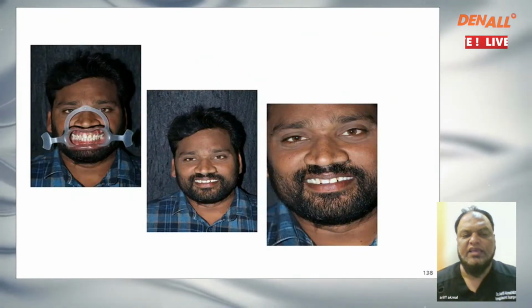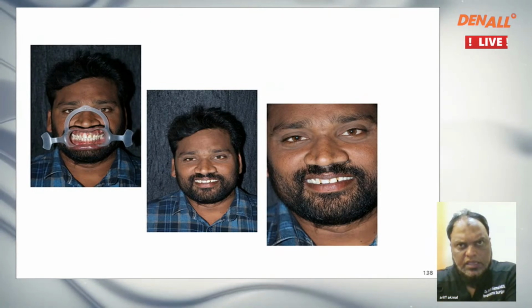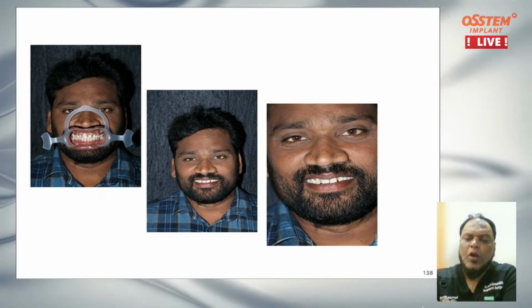Okay, this is another interesting case. A very, very young boy. He was somewhere around 23 years old when I did this procedure on him. Young boy, history of accident. He had gone to another dentist, who gave him a very, very bad flipper. Look at how odd that smile is. And he came to your clinic saying, sir, I want to improve my smile. Can you help me out?